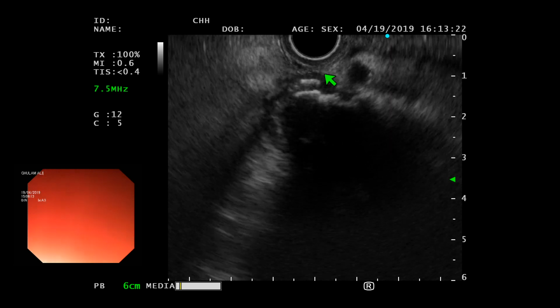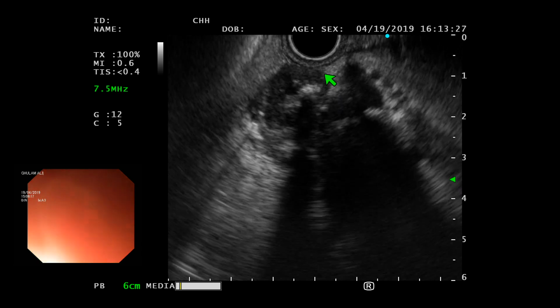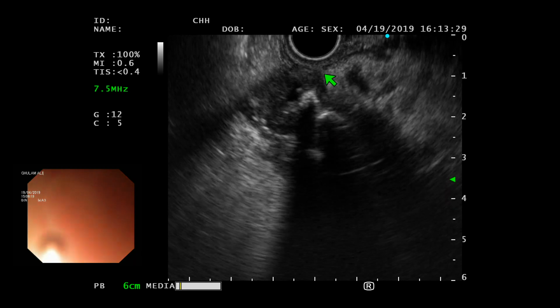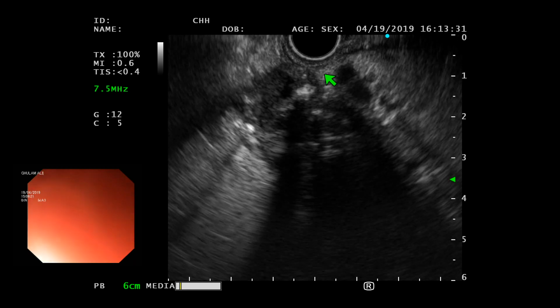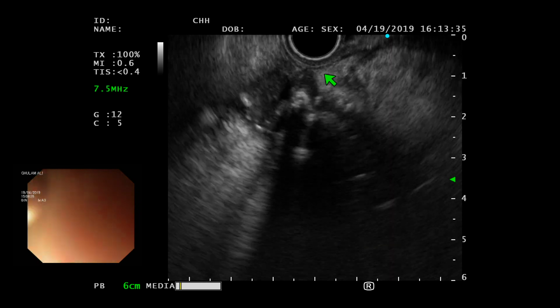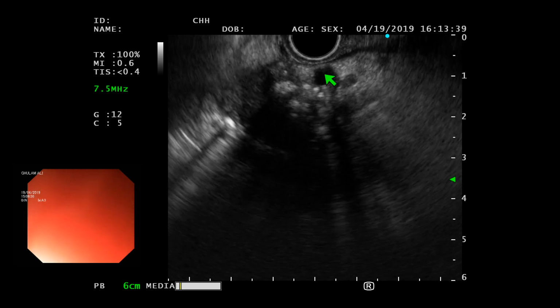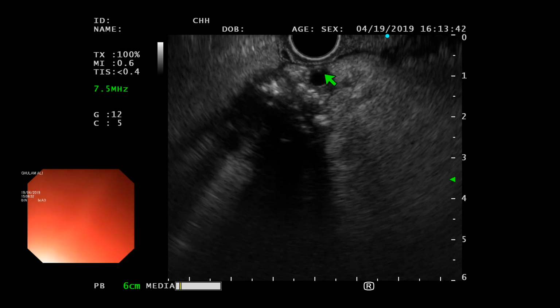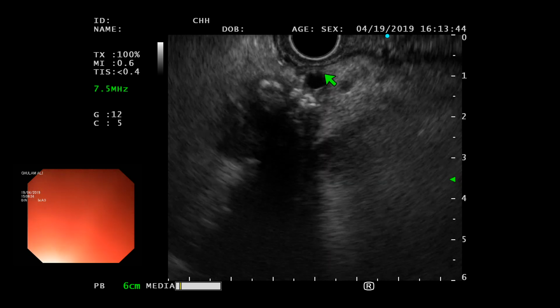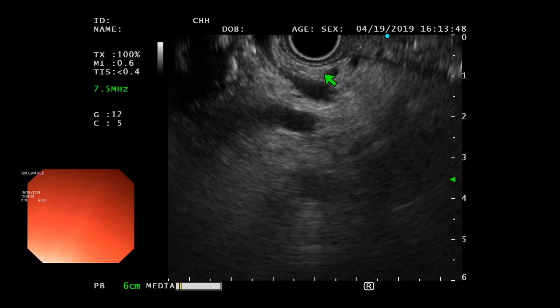On the CT scan, there's encasement of the celiac artery as well. Do you see any encasement? I did not, honestly. If you look at that, you can follow the celiac artery very nicely without any problem. I'll have to take another look. But what I see now, I did not see really anything. So I'll take another look. The SMA may have been involved.